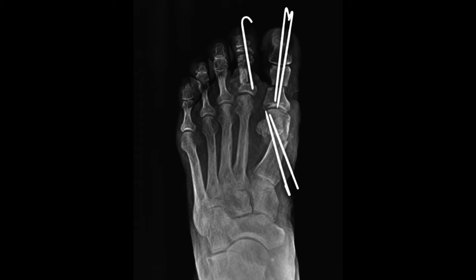The distal fixation goes into the cortical bone, into the medullary canal, and into the distal fragment. Then our proximal fixation goes cortex, cortex, into the distal fragment.